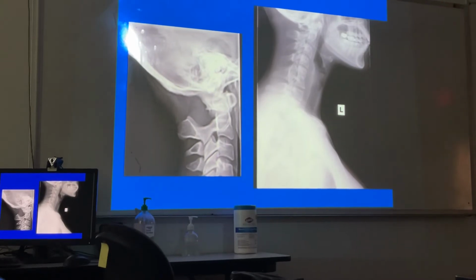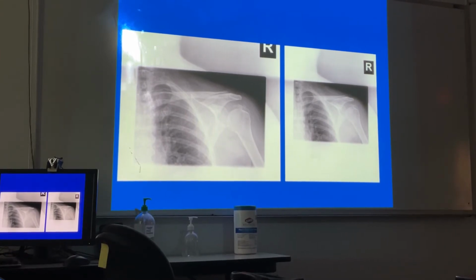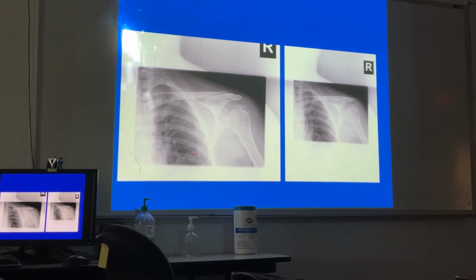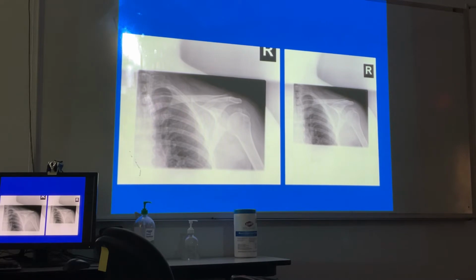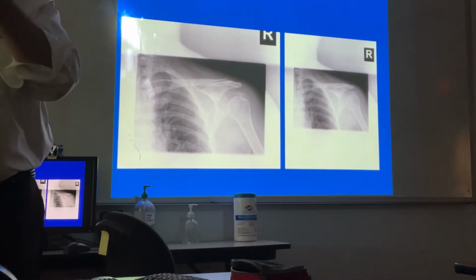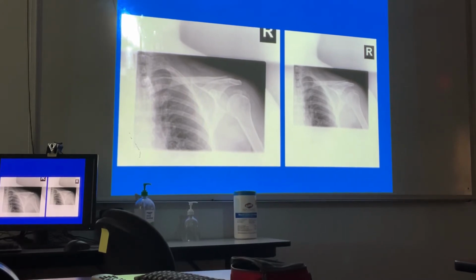Okay? Am I wrong, or is that the wrong marker on there? Is that a PA view then? No, it's a right, okay? If it was a left, it should have shown a portion of the heart unless we missed it. So it's all good. This is the accepted position. Okay, if I turn this way and put the right marker here, the X-ray is going through everything, right? I thought it was the wrong marker because it was a PA. If I'm looking A to P, is that not the left shoulder?